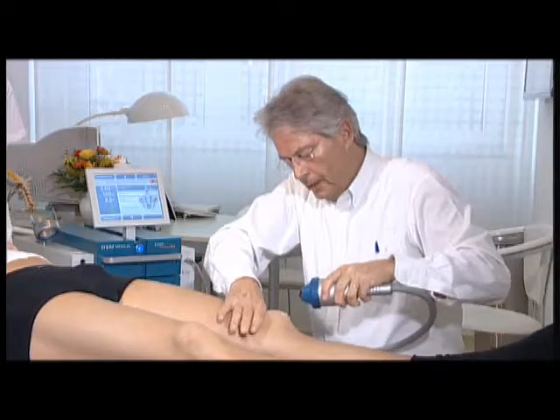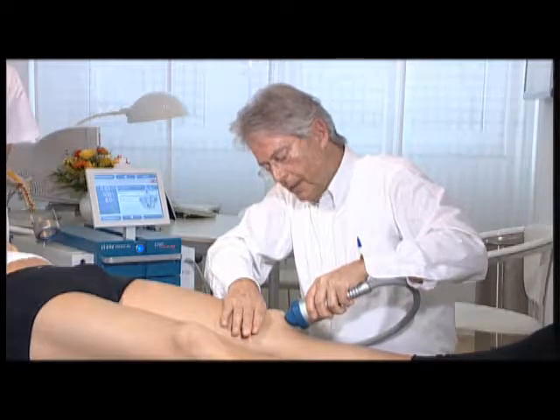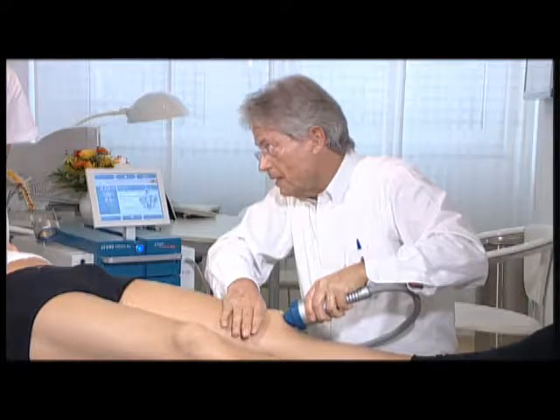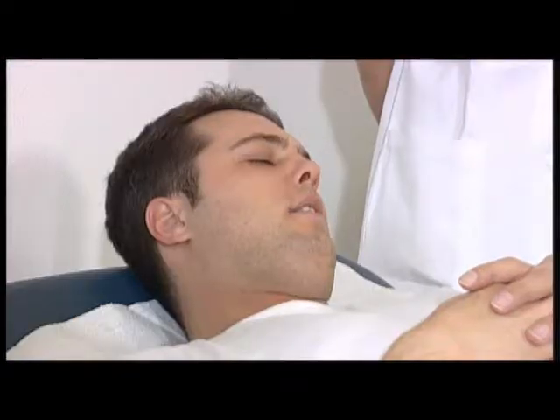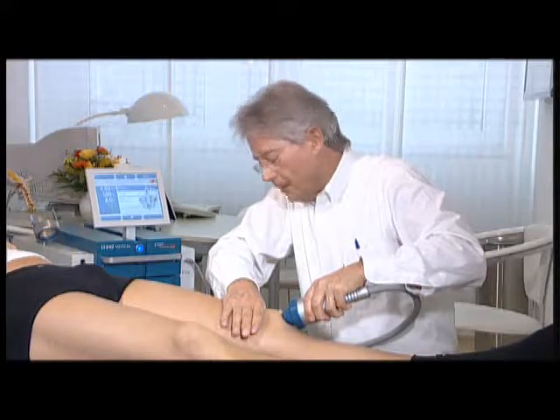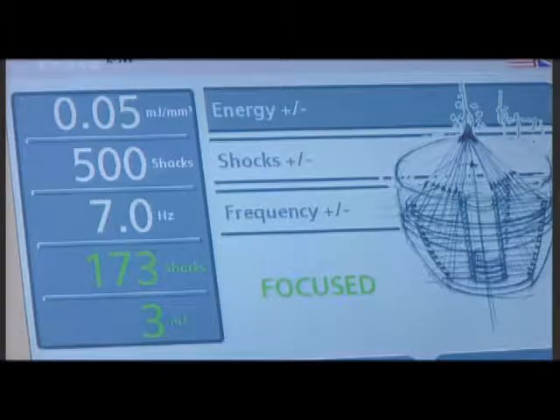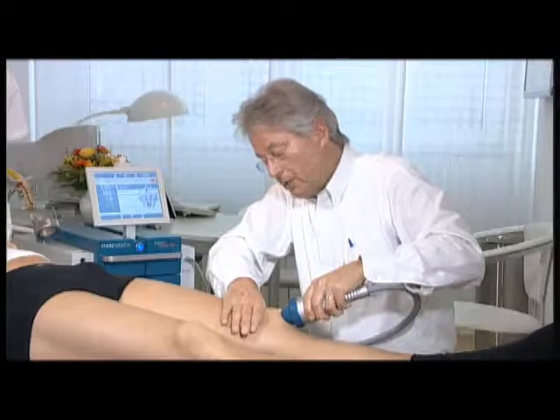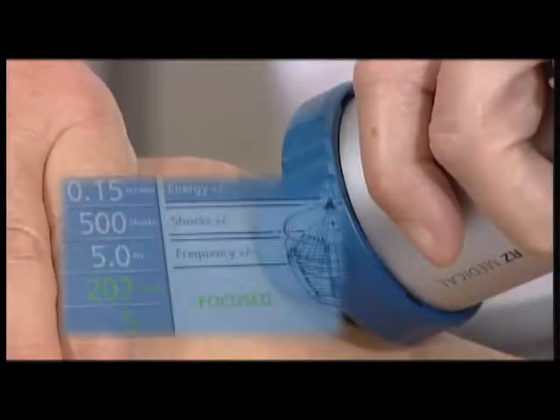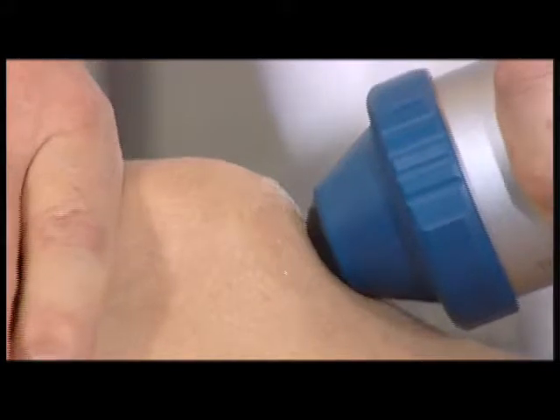Ich bleibe hier oben mit der Hand liegen und setze jetzt bei 6 Uhr an. Application is started at the lowest energy level. The selected delay line determines the therapeutic penetration depth. The energy level is then adjusted to the recommended setting so that the diagnostic use of focused shockwaves can be followed by the actual therapy without any interruption.